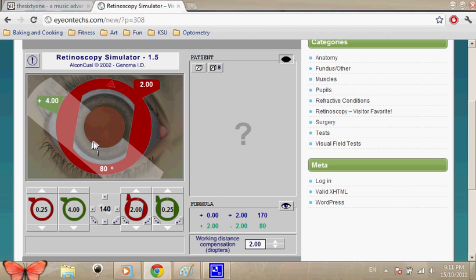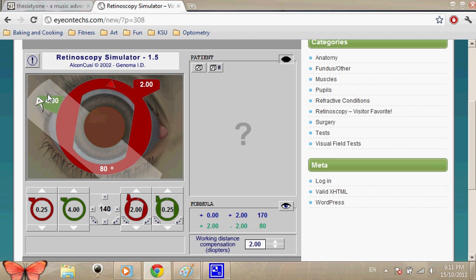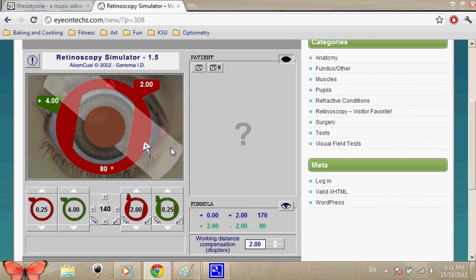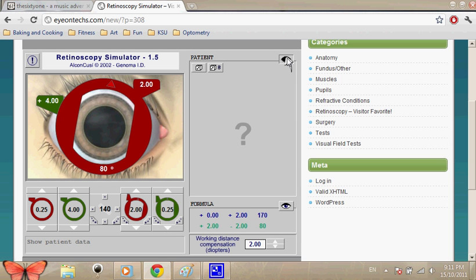We're going to be taking the minus cylinder form as we fixed the plus meridian with the plus sphere. Okay. That's why we got the minus cylinder form. And that's what we usually use. So, that's the sphere cylinder method. I hope you have a clear image of what you're supposed to do during the test. And good luck.